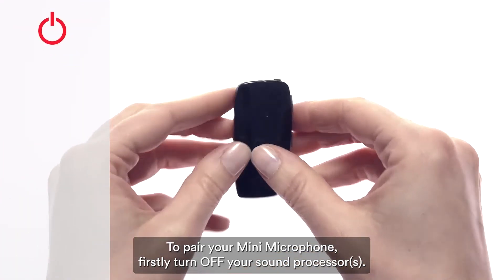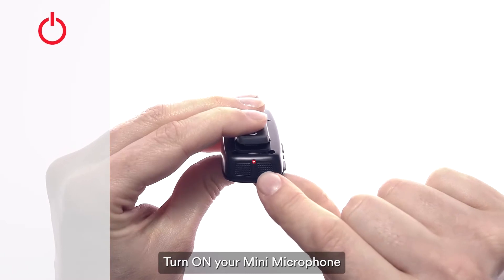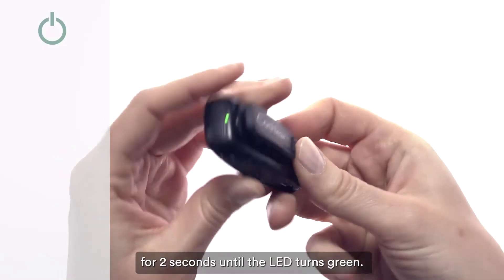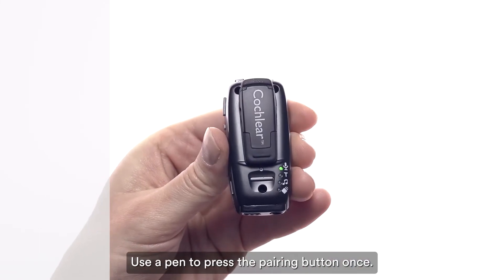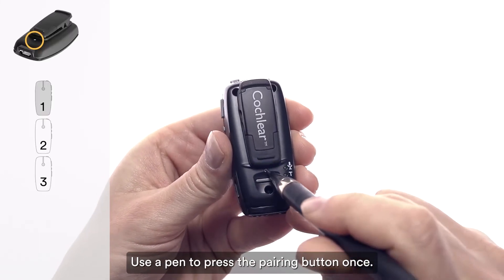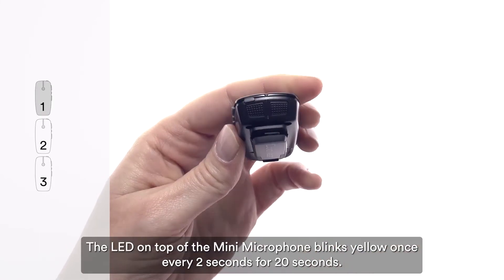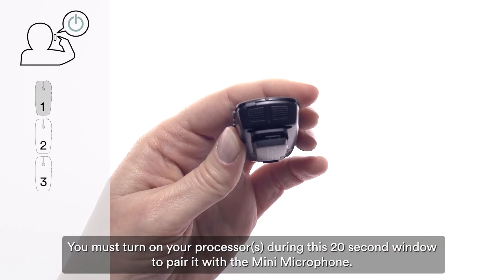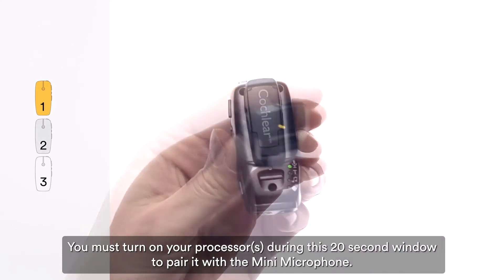To pair your mini microphone, firstly turn off your sound processor. Turn on your mini microphone by pressing and holding the on/off button for two seconds until the LED turns green. Use a pen to press the pairing button once. The LED on top of the mini microphone blinks yellow once every two seconds for 20 seconds. You must turn on your processor during this 20-second window to pair it with the mini microphone.